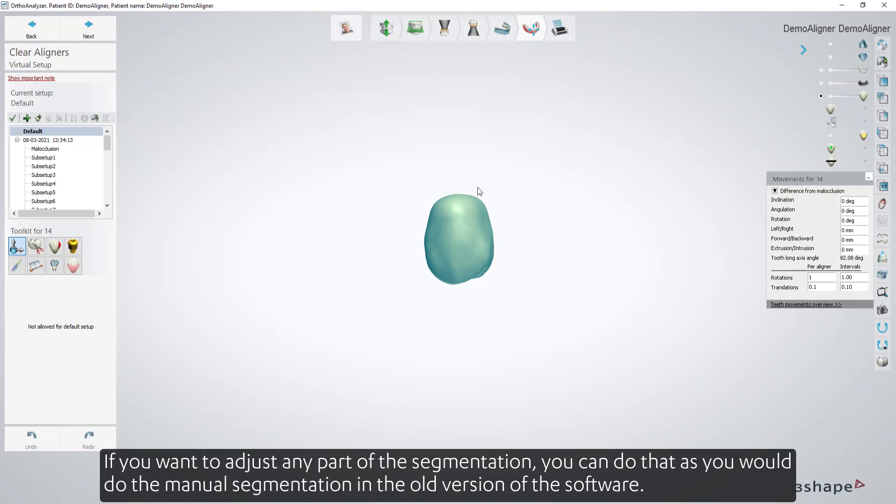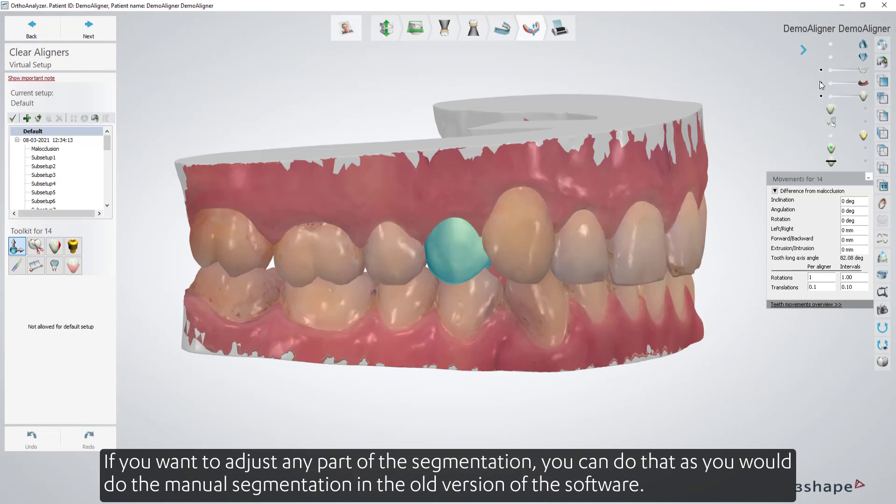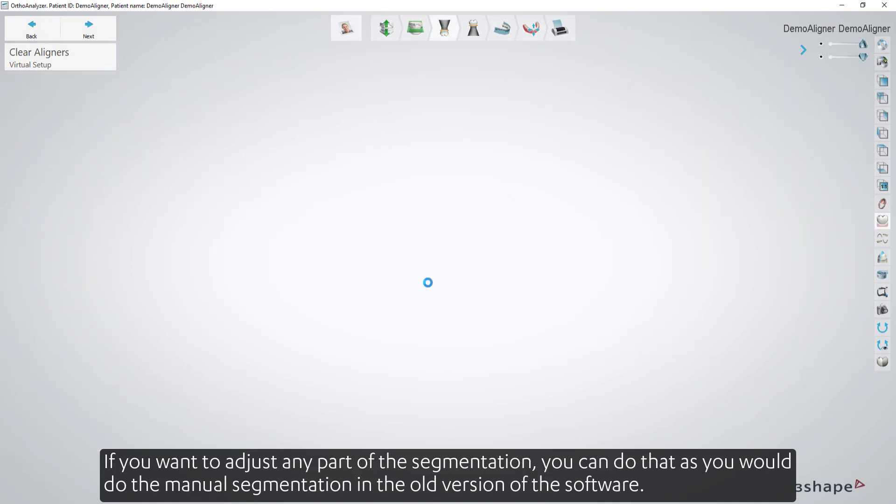If you want to adjust any part of the segmentation, you can do that as you would do the manual segmentation in the old version of the software.